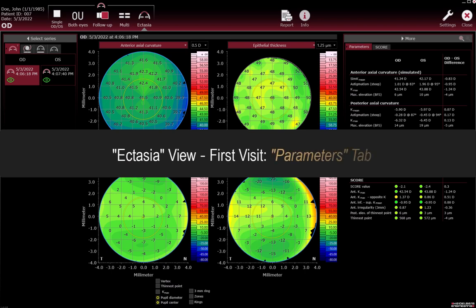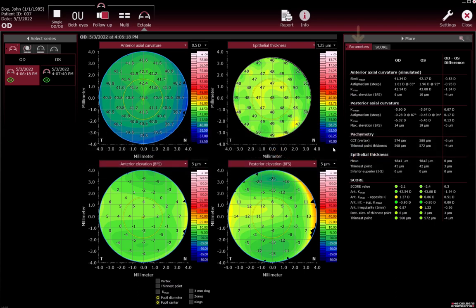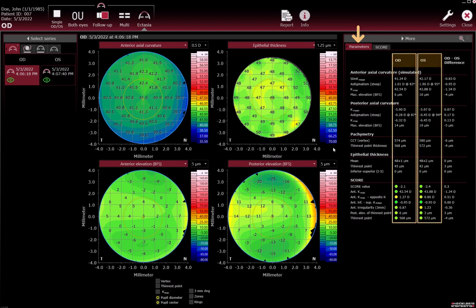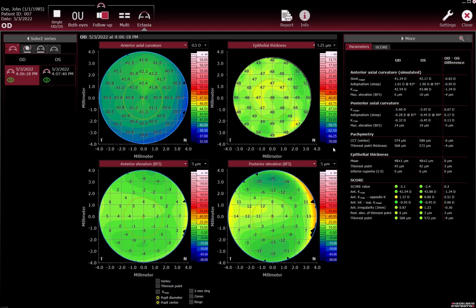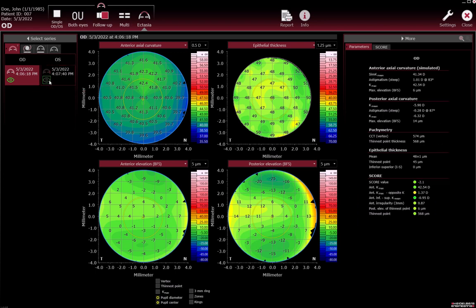Ectasia view first visit — Parameters tab. On the Parameters tab in the More section, review the measured values for OD/OS and the OD/OS difference. To deselect an examination, click the green eye icon. To select another possibly available examination at the same day, click the black eye icon, which makes it turn green.